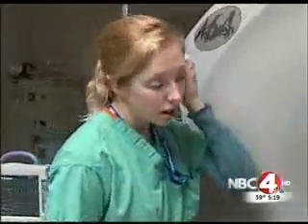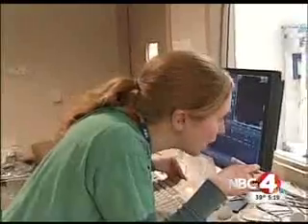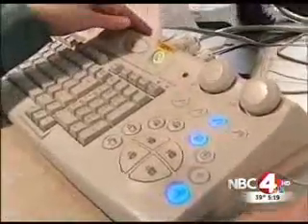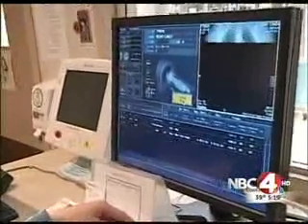You're going to hear a woman's voice come over the intercom. She's going to tell you when to breathe and when not to breathe. Okay, we're going to get started. Take a breath in and hold it. Basically, it's looking at the arteries of the heart, literally inside them, for early signs of plaque buildup.